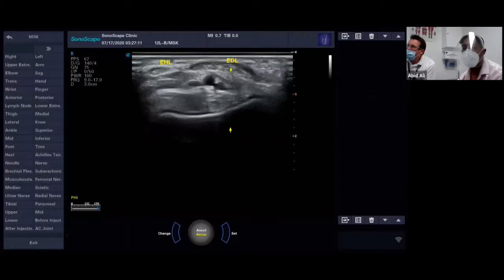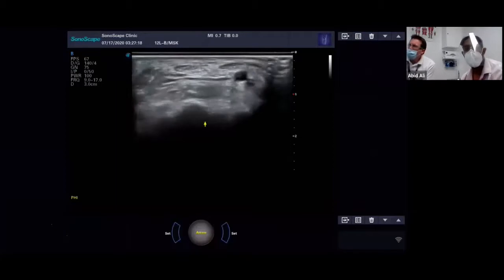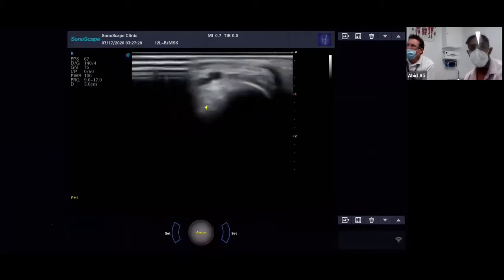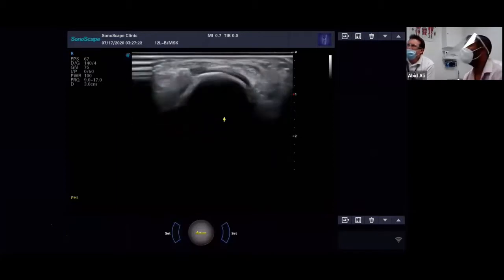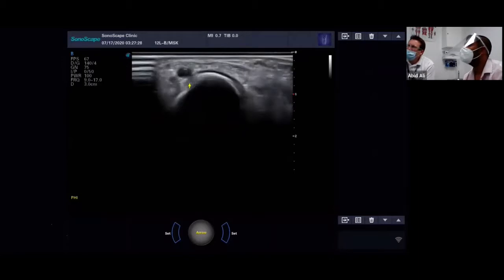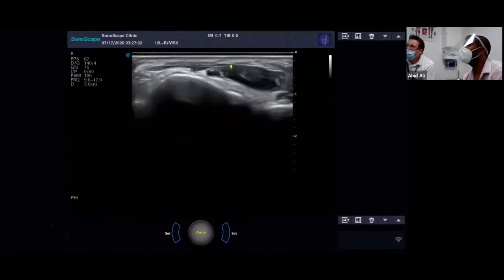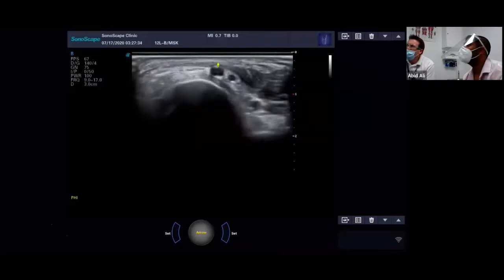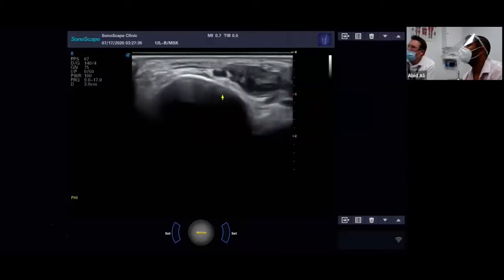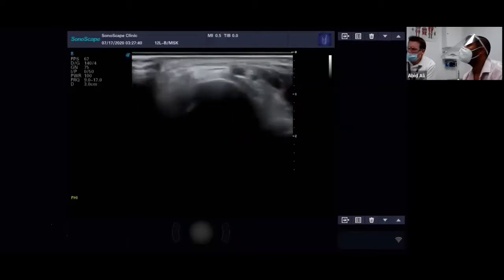So obviously, if we follow that complex down, it'll split off into the 4 branches that go into the toes, which we might just try and show you now. So if we stay on there. Okay, so you can see the artery pulsing away there. And now we're just going to come down. See if we can see the splitting off. Split the focus a little bit, maybe. Shows a bit there, isn't it?